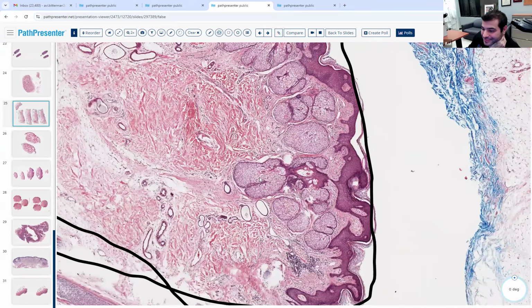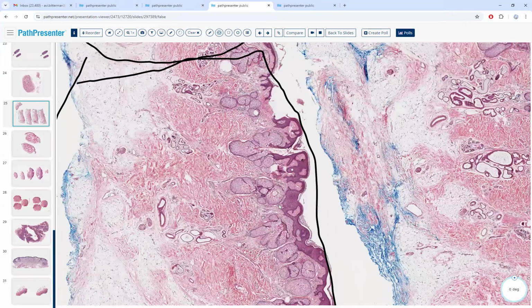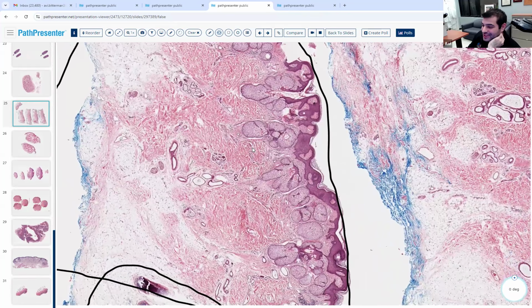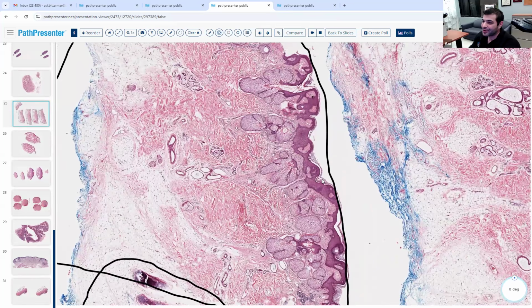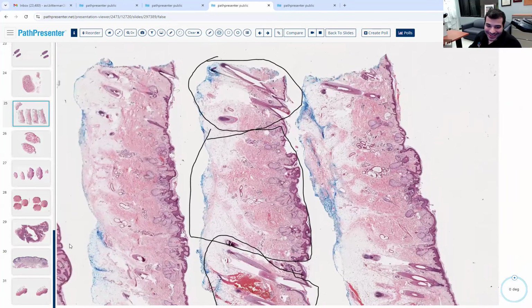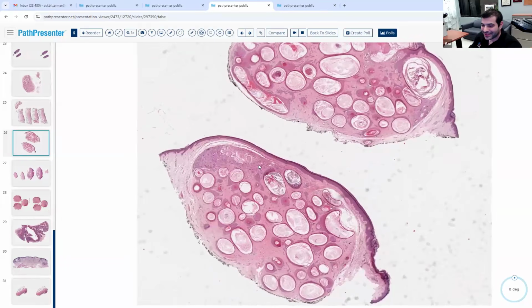Why is that? Is it because of the puberty hormones? Yeah. Okay, yes. So the maternal androgens in utero will develop these sebaceous glands. And so it'll have that kind of appearance in nevus sebaceous at birth. That will regress because they haven't hit puberty yet, and so they don't have those androgens. And then when they hit puberty, they'll hypertrophy again. So it has multiple stages as we go through life, the nevus sebaceous. What about this thing?